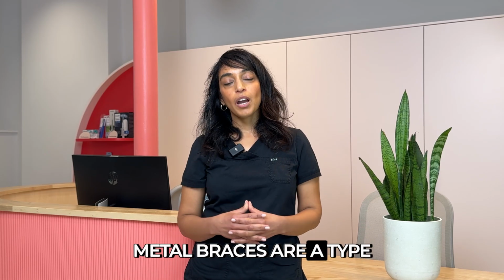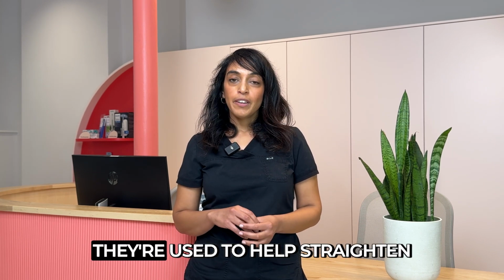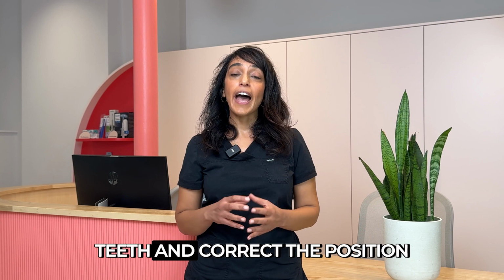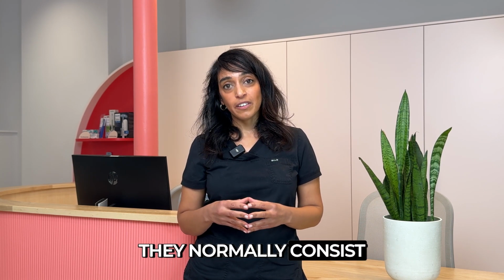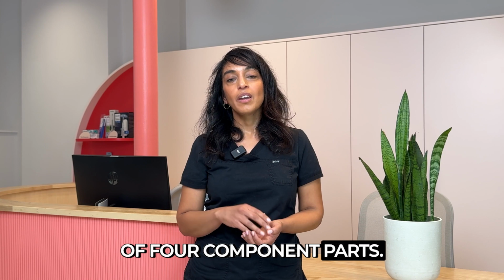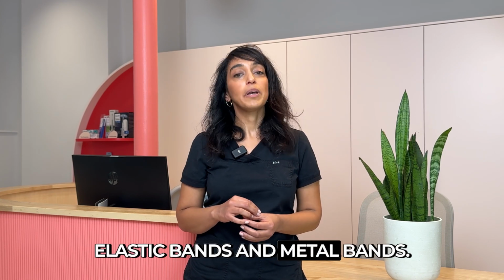Metal braces are a type of orthodontic appliance, usually made of stainless steel. They're used to help straighten teeth and correct the position of jaw malalignment. They normally consist of 4 component parts: metal brackets, wires, special elastic bands, and metal bands.